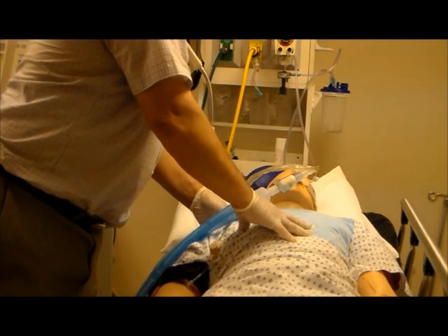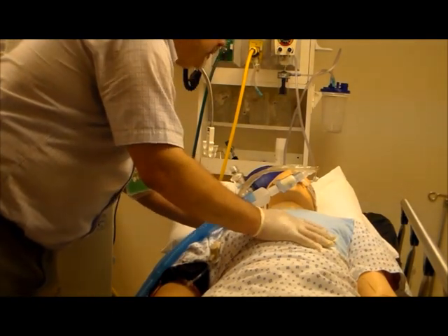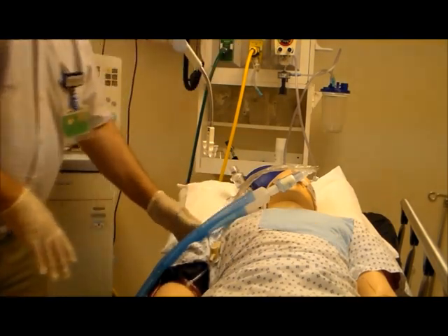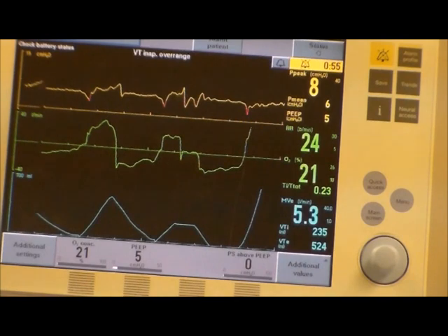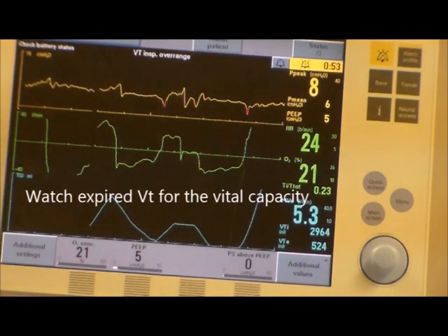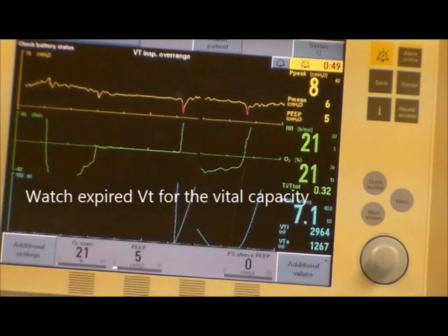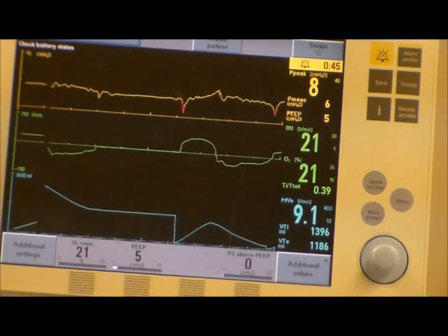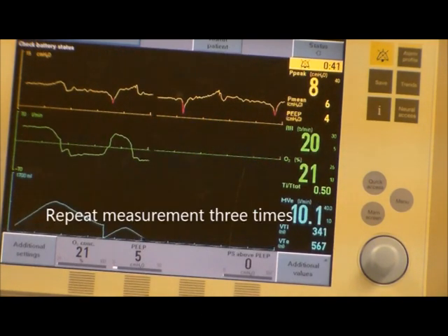Keep going. Okay, now push it out — blow it out, push it out. You don't have to go very fast, just get it all the way out. Very good. Okay, back to normal breathing. While they're doing this, you want to make sure you're checking the expiratory tidal volume in the bottom right corner — that will be your vital capacity. Ideally you would do this three times to make sure you get three consistent numbers.